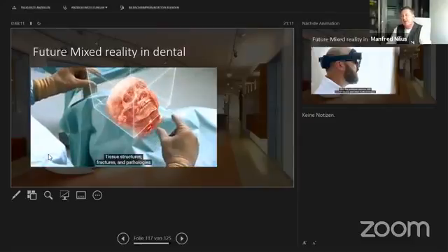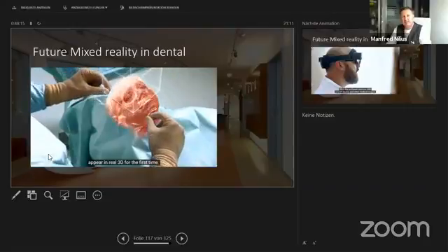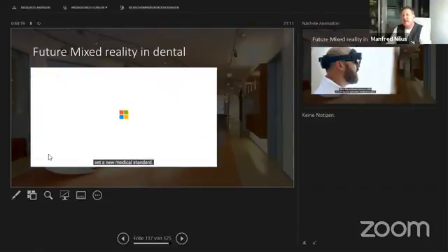The system is called Mixed Reality, and it's based on the DICOM data that were implemented. And the HoloLens 2 is available since February this year, and they develop in 3 month steps new technologies to go through the patient, to go into the patient, to have the conversation, to show.